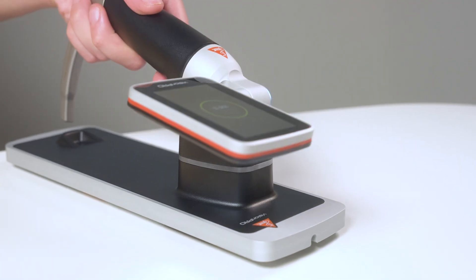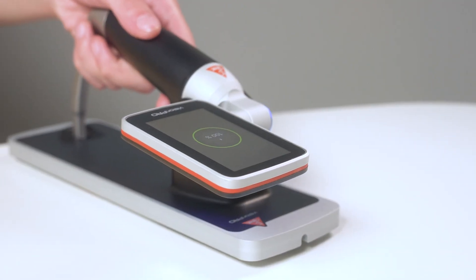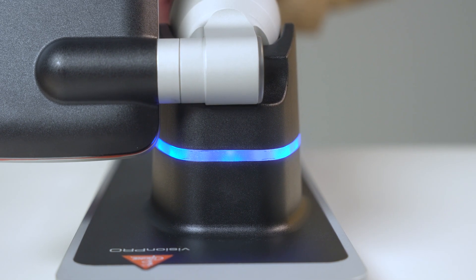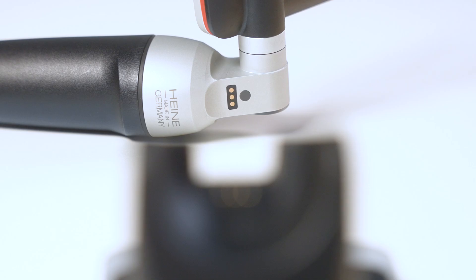The Heine Vision Pro set includes its own charging station. If you want to recharge your instrument, simply place the device as shown in the video. The illuminated ring on the charging station indicates that the Vision Pro is properly connected. If not, the Vision Pro might not be linked to the pins of the charging station, or the station is not fully connected to the main supply.